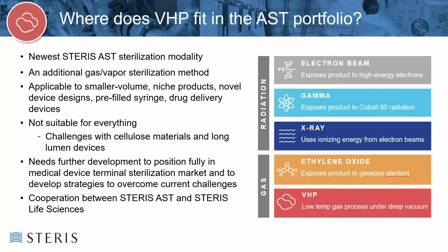So with this in mind, and with how VHP is the newest modality in our portfolio, it does still need some further development to fully position it in the medical device terminal sterilization market, as well as come up with strategies to overcome these challenges that we're seeing at the moment.